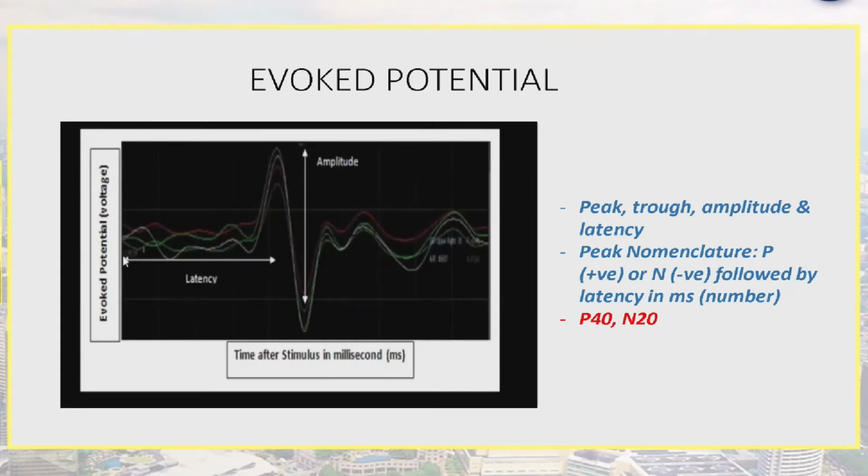Okay, before I proceed more, this is evoked potential, one of the responses that we record during IOM. As we can see, evoked potential can be stimulated by electrical or magnetic means, and usually we observe either motor or sensory. This is its SSEP response. There are two things that we look upon.